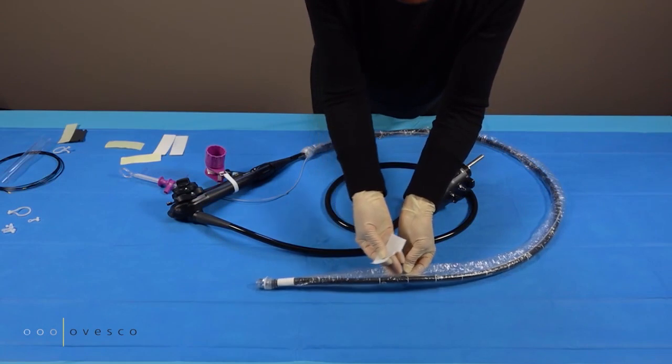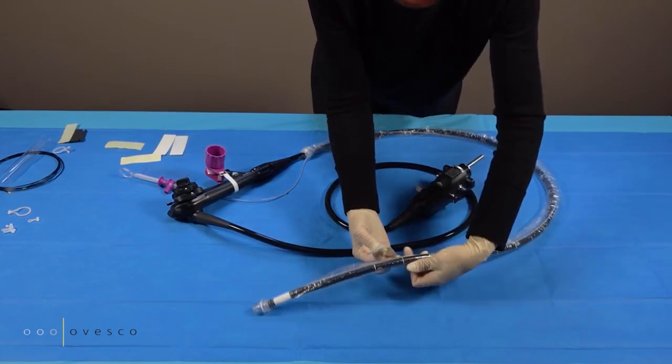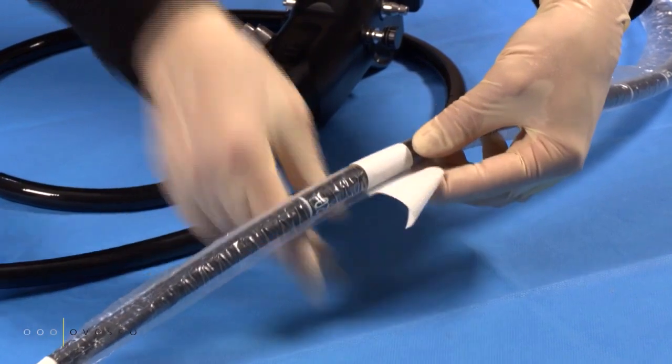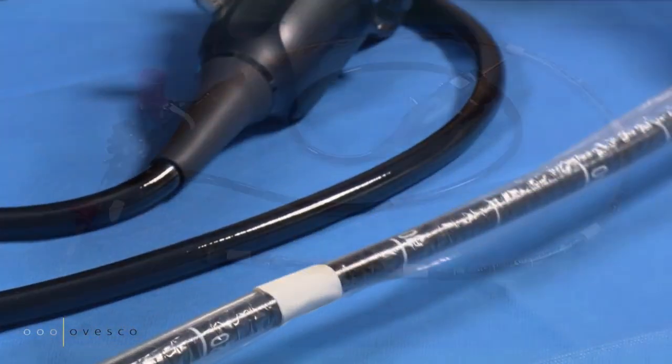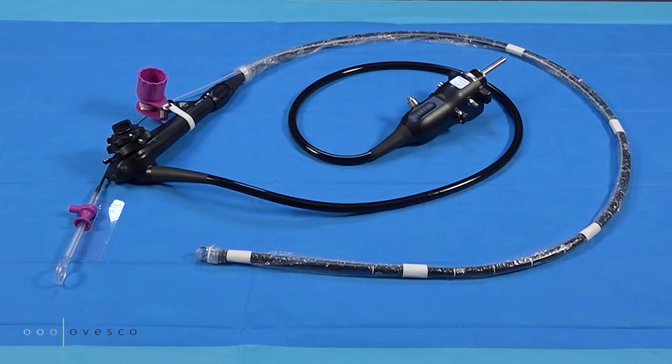Fix the endoscope sleeve with additional tapes. The FDRD system is now ready to be used.